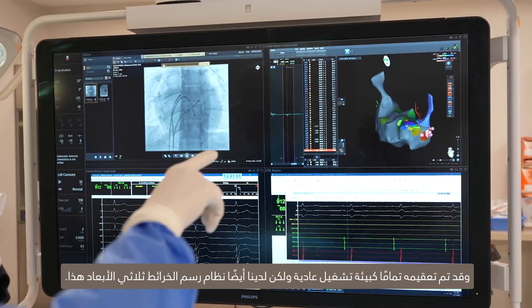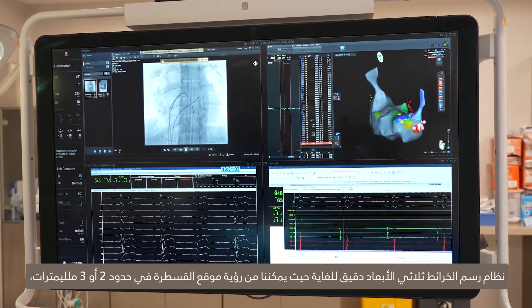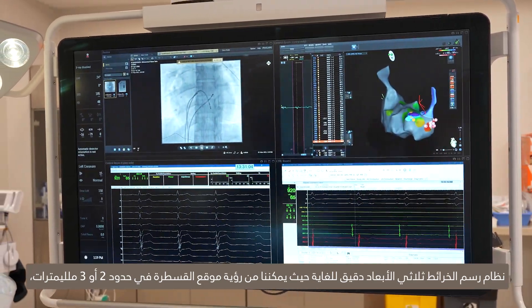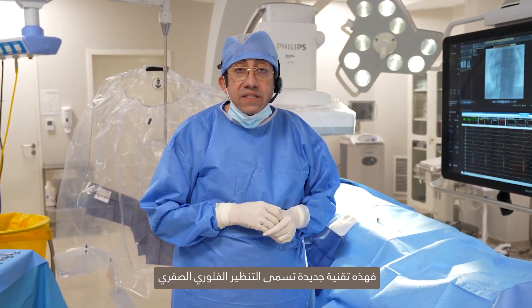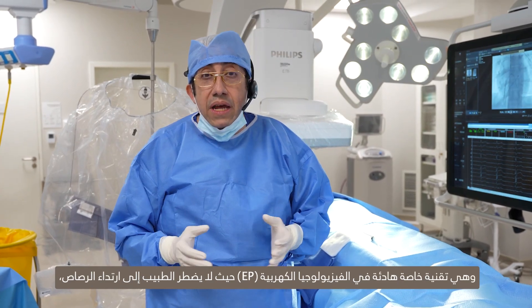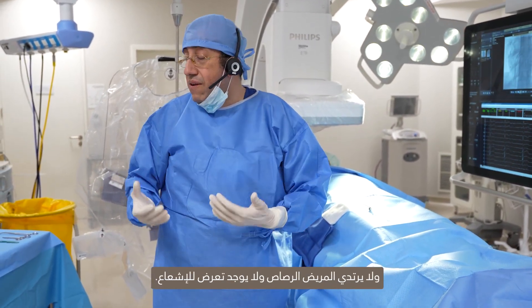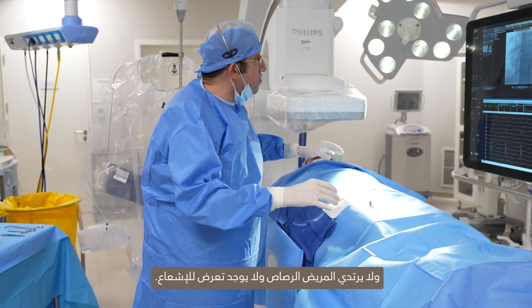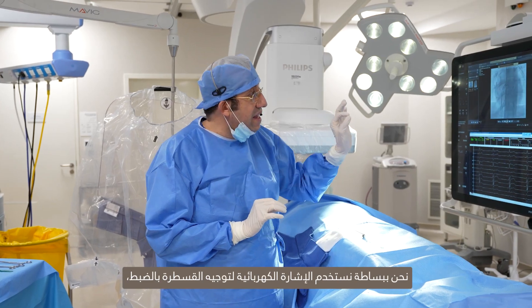We also have this 3D mapping system, which is so accurate we're able to see the catheter location within two or three millimeters. We don't actually have to use x-ray. This is a new technique called zero fluoroscopy. It's quite special in EP labs where the physician does not have to wear lead, the patients don't have to wear lead, there's no radiation exposure, and we are simply utilizing the electrical signal to guide the exact catheter.